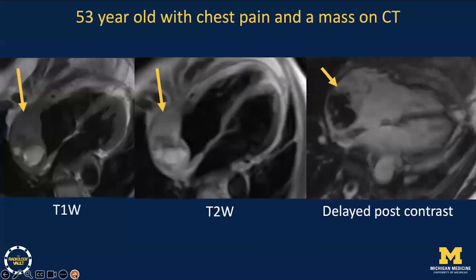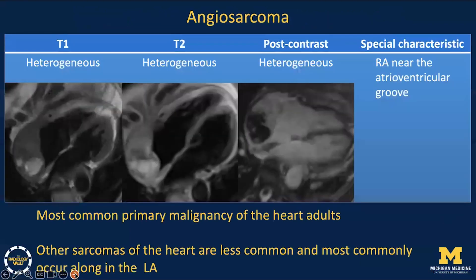Finally, this is a 53-year-old with chest pain found to have a mass on CT. Angiosarcomas are heterogeneous on T1 and T2-weighted sequences, and show heterogeneous enhancement after contrast administration. These tumors have an aggressive appearance, and most commonly occur near the right atrium at the atrioventricular groove, as we see in this case.